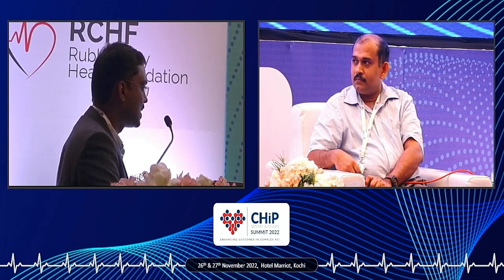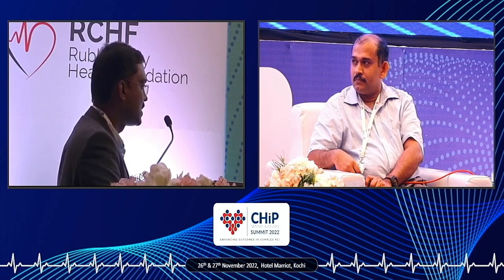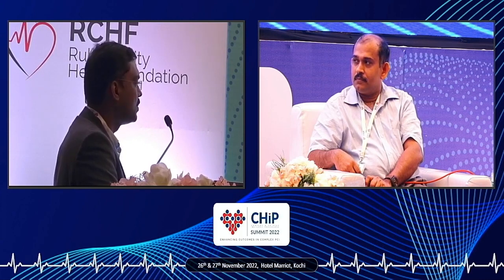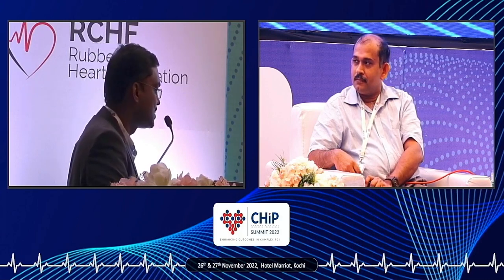If it is under-expansion, you can just expand it with the help of a high-pressure balloon, or if there is persistent calcium, as the previous speaker said, you can do an IVL. Once you expand it, there are indications for DCB and there are indications for restenting. Only one trial says EES is better than DCB. Otherwise, of late, there are emerging uses of DCB. I am a favorite of DCB. I have some follow-up also with DCB in in-stent restenosis.